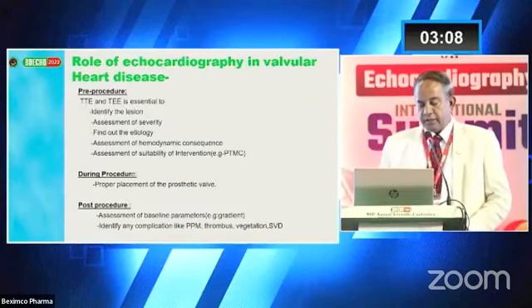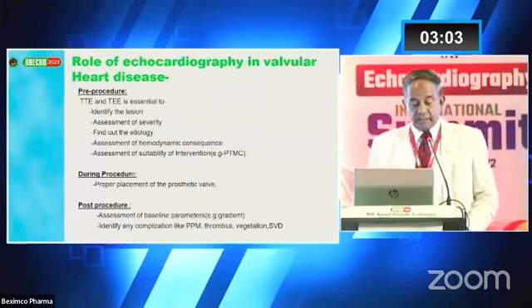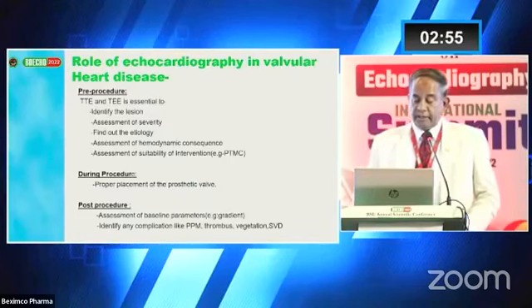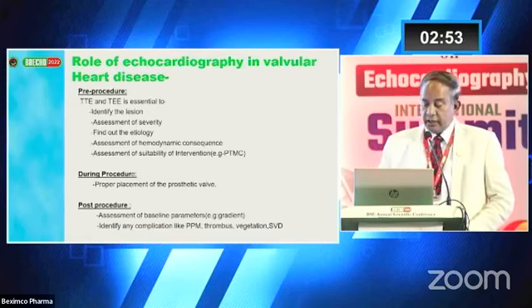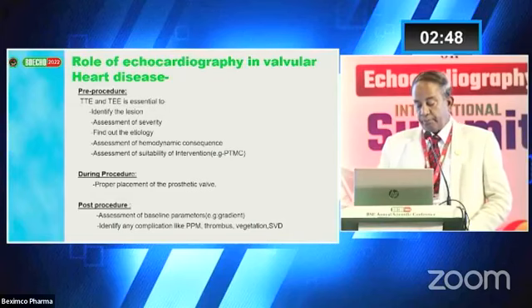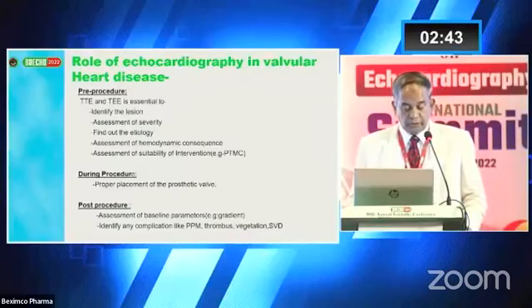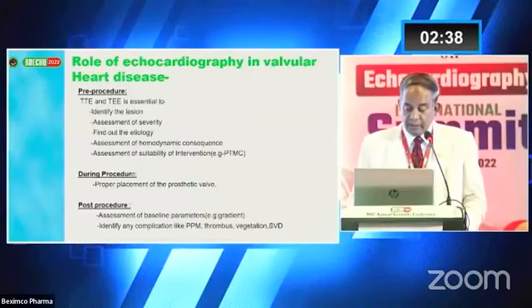We have seen by echocardiography. We assess pre-procedurally: identify the lesion, assess the severity, find out the etiology, assess the hemodynamic consequence, and assess the suitability of the intervention. During the procedure, is there any complication? We also assess the gradient and residual complications of the procedure.